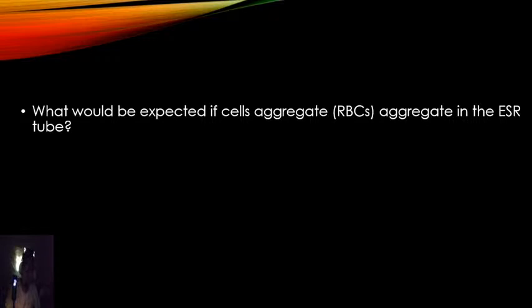That's why even if you're doing ESR analysis, you are supposed to refrain from using coagulated or clotted samples, because there's obviously aggregation of RBCs. But of course, aggregation and agglutination are different. Aggregates can be dislodged, but agglutinates cannot be separated with just a couple of flicks of the test tube. That's the difference between aggregates and agglutinates.